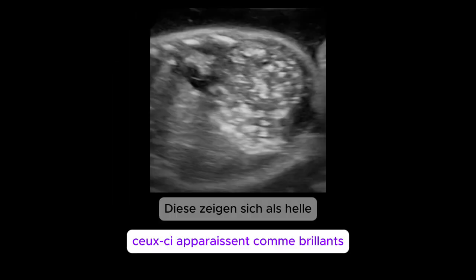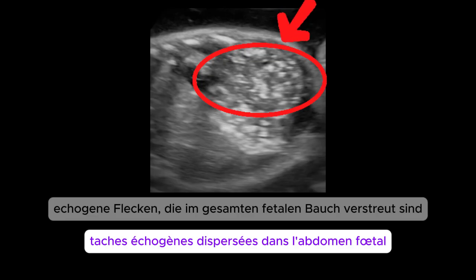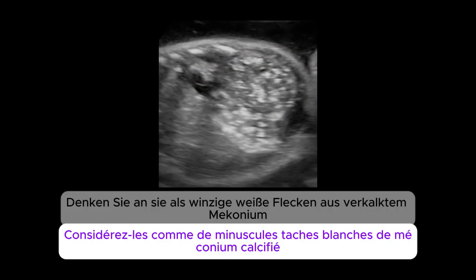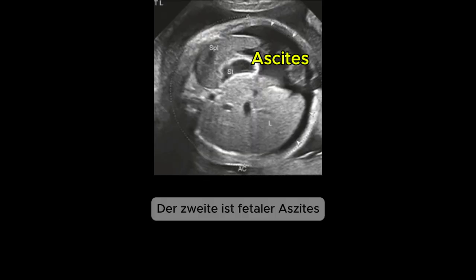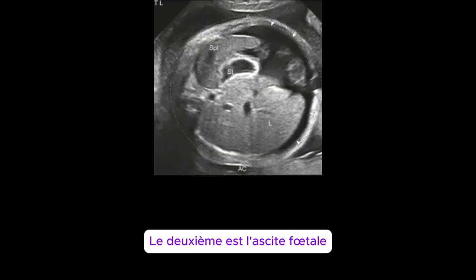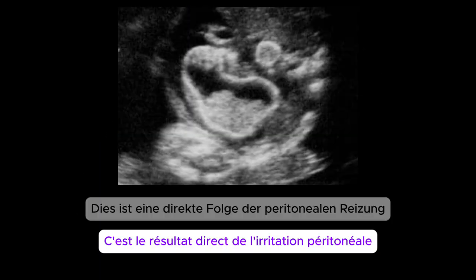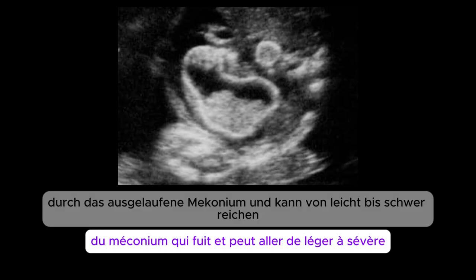These show up as bright, echogenic spots scattered throughout the fetal abdomen. Think of them as tiny white flecks of calcified meconium. Second is fetal ascites. You'll see free fluid in the baby's abdomen. This is a direct result of the peritoneal irritation from the leaked meconium and can range from mild to severe.